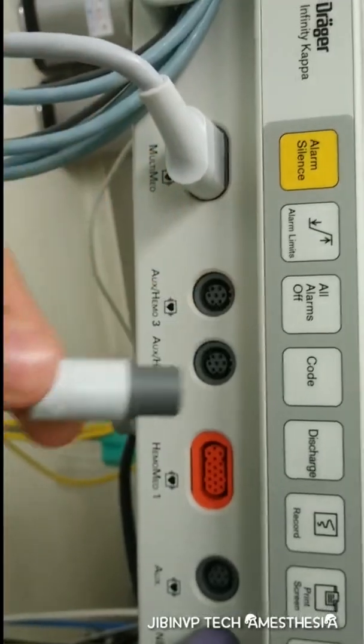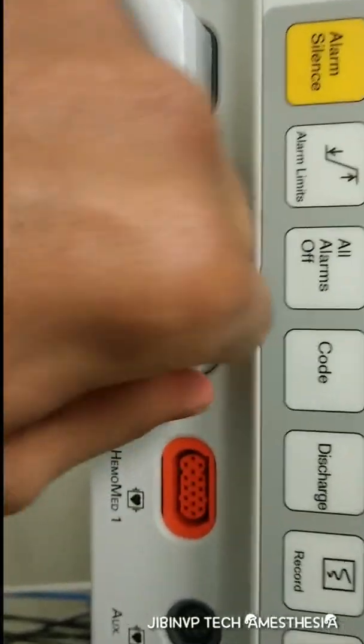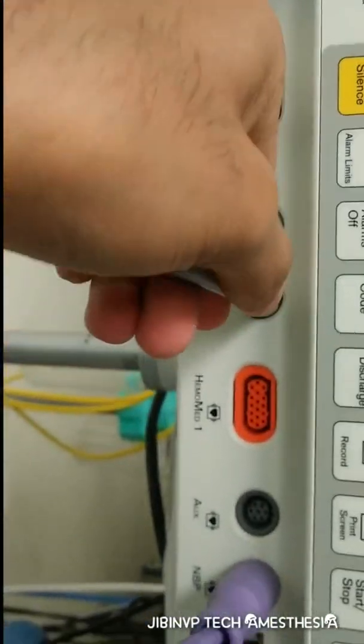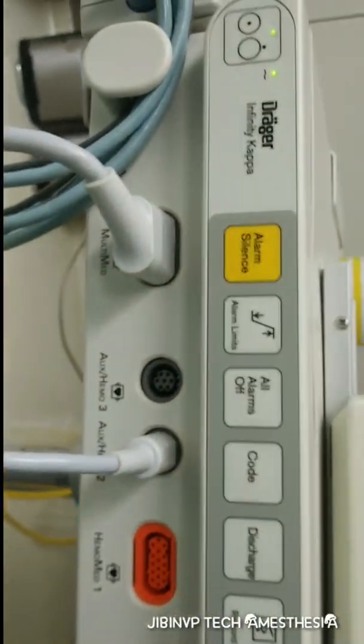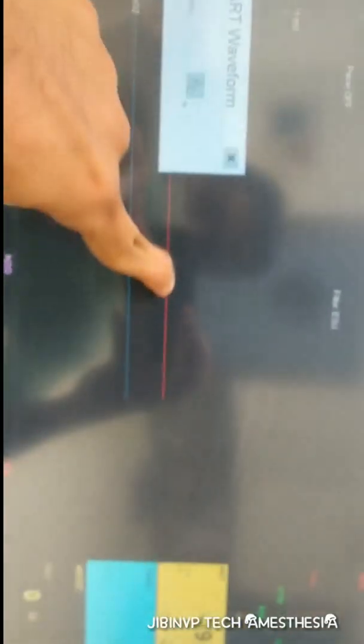The monitor is automatically representing the arterial pressure waveform, but we haven't connected it to the patient line yet. Now connect this end to the patient line, and just like that we can proceed to zeroing.